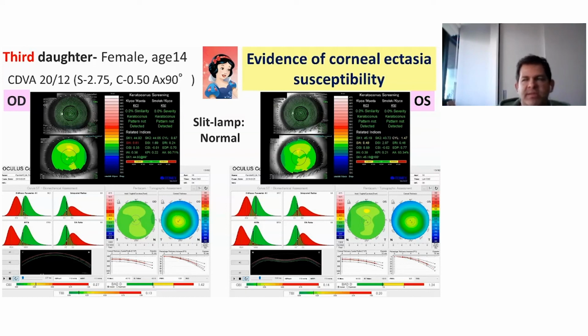If the patient has a history of keratoconus in the family, I would not say you're not a candidate for LASIK at all. Of course not. I take the individual consideration of the data, and if the data looks good, the patient may have a family history positive for keratoconus, but it's not a very major abnormality for me. It's definitely something to be considered, but it's not overweighted in my practice.